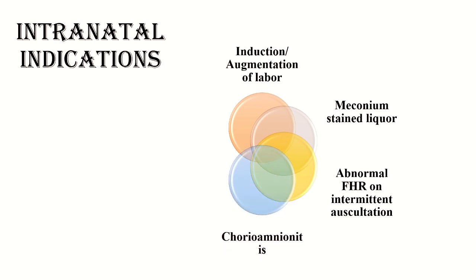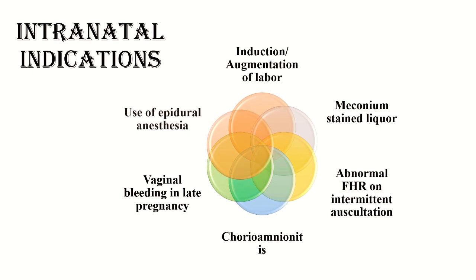In case of chorioamnionitis, vaginal bleeding in late pregnancy, use of epidural anesthesia as a side effect, the fetal heart rate can decrease. So these are the various indications in the antenatal and the intranatal period where we might need to perform a CTG.